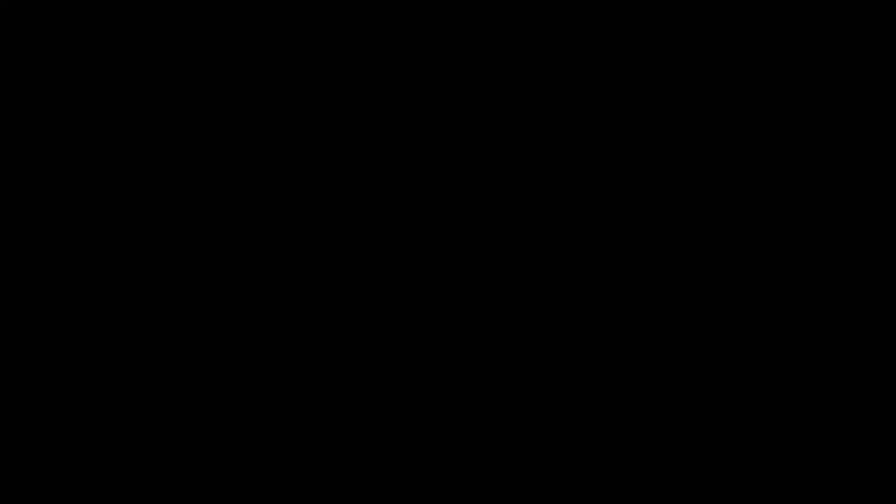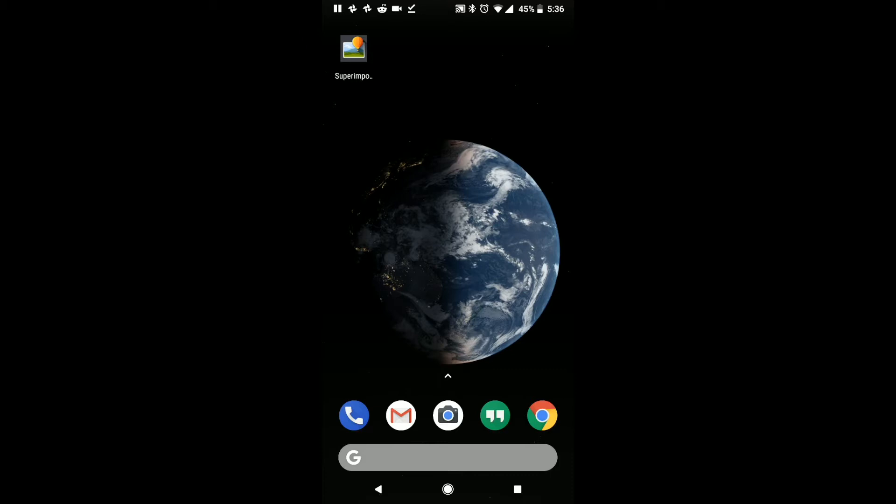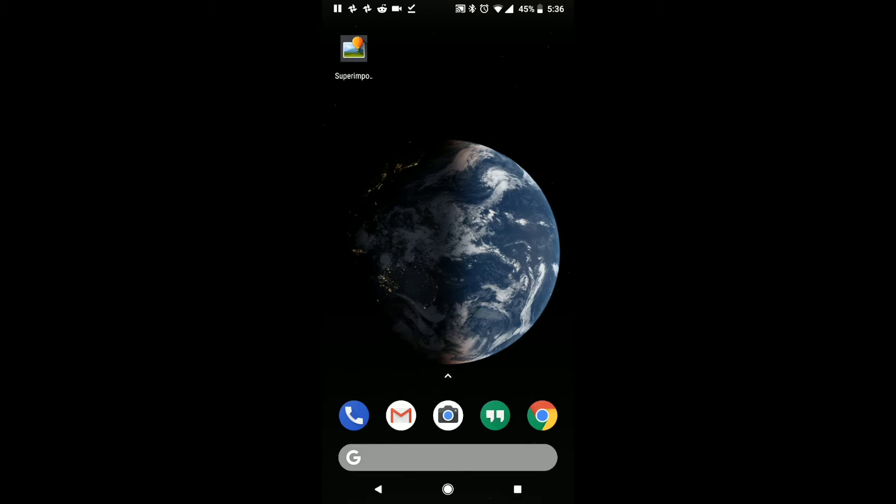This is Josh Young, and I am doing the Android portion of this because I'm an Android person. So the first thing that we're going to do is we're going to make sure that we have downloaded an app called Superimpose, which you see on this screen. Let me just show you where it is. So we're going to go to the Play Store.